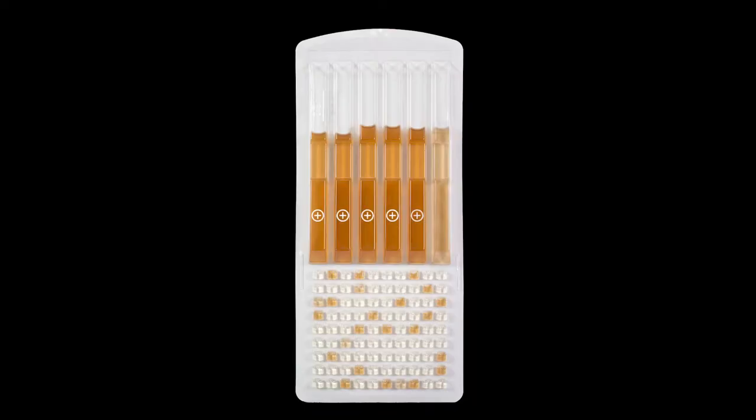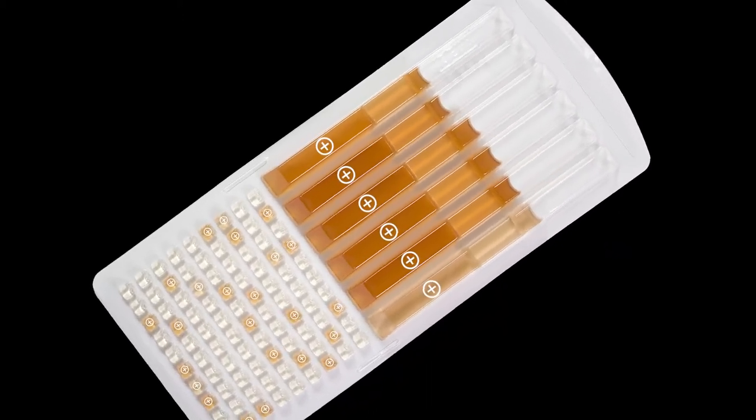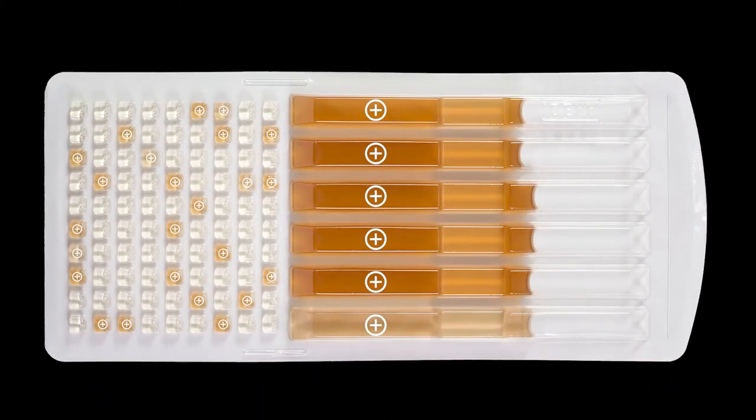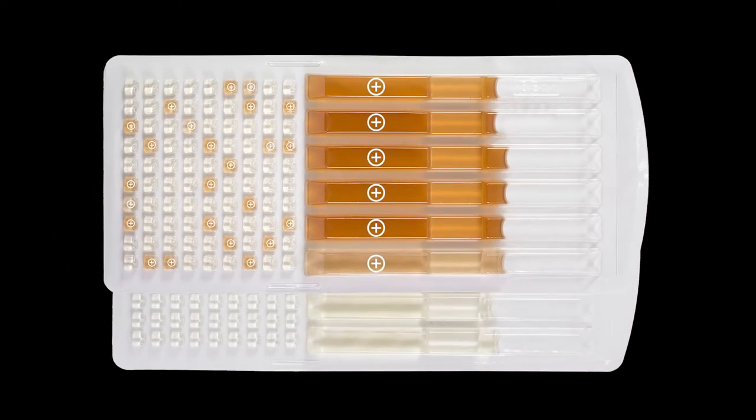Any change to a brown color and or turbidity greater than the negative control indicates a confirmed positive for Legionella pneumophila. Here is an example with both strong and weak positive wells. There are a total of 6 positive large wells and 24 positive small wells.